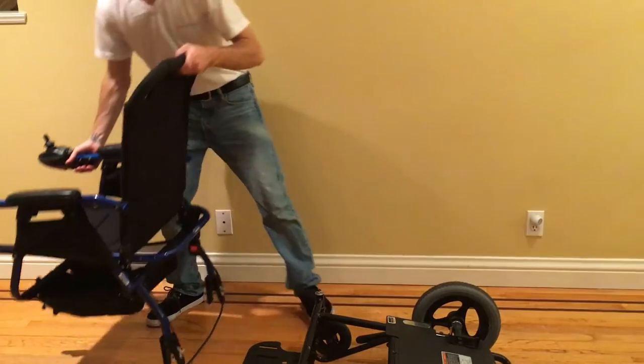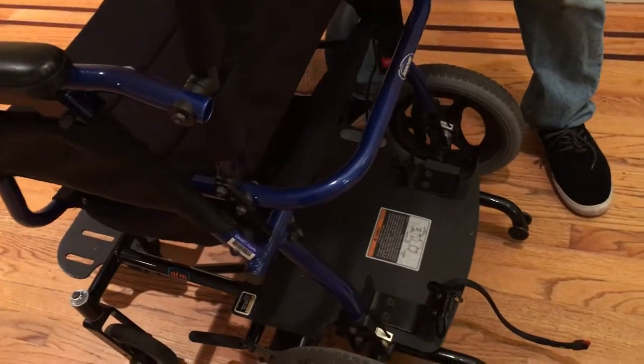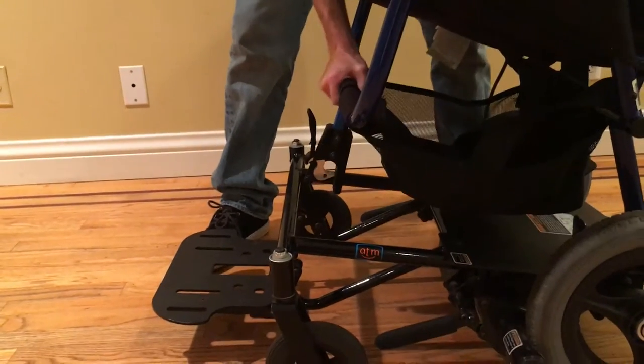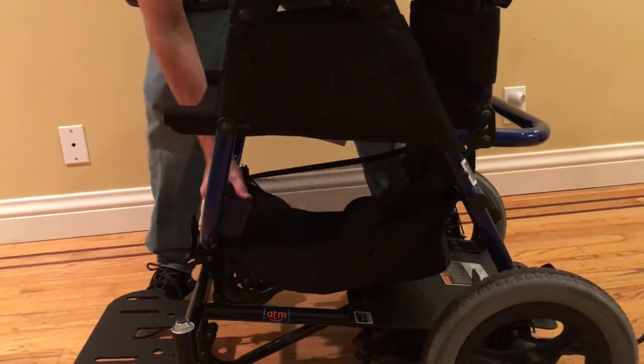The first thing you want to do is attach the two prongs back into the back wheel axle. Then we'll go around to the front and adjust the chair to fit into the front rod — it clicks right in.